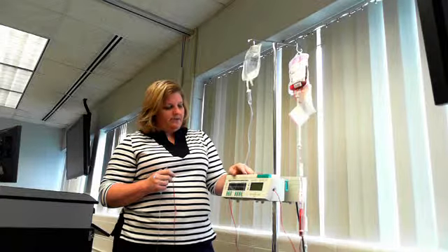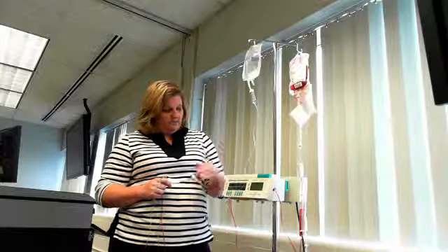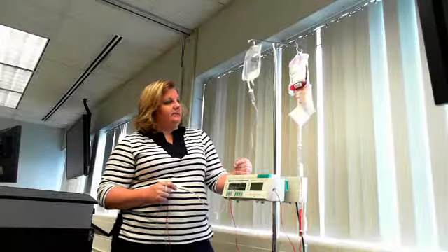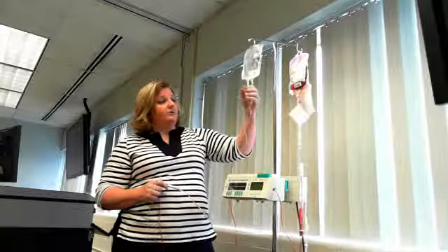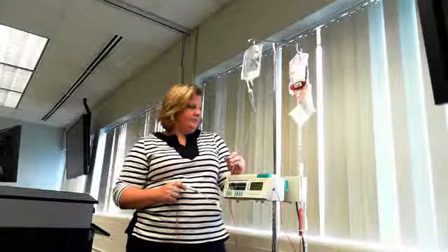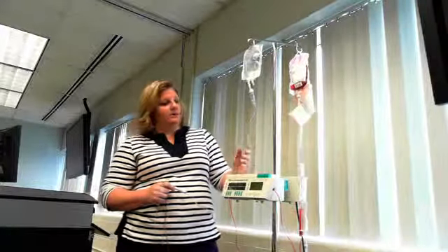After 20 minutes, if the patient hasn't had any reactions, you can increase the blood rate up to a maximum of 150 mL per hour. If the patient has any renal or cardiac impairment — such as kidney failure or CHF — you would run the blood slower and closely monitor their lungs for fluid overload. If you notice shortness of breath or crackles in the lungs, stop the infusion and contact the doctor about managing that fluid overload.